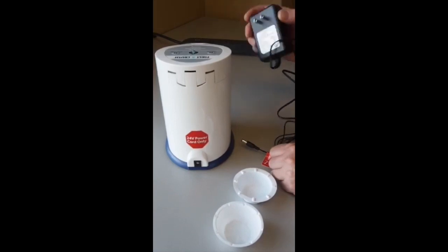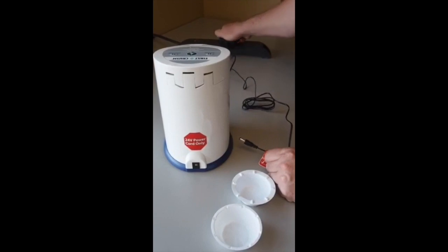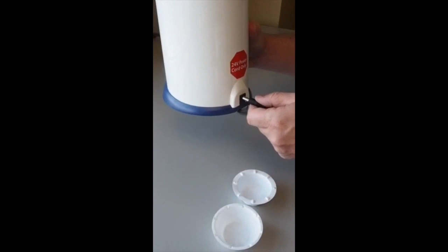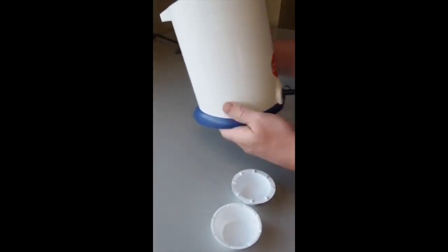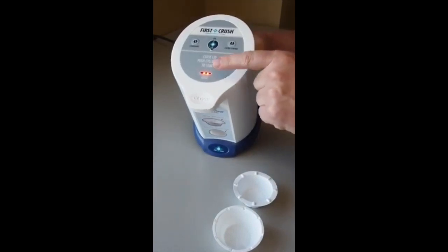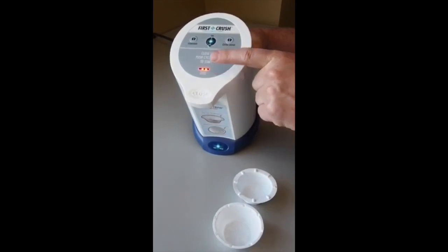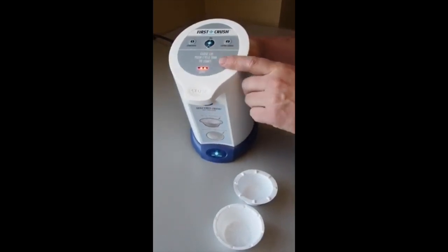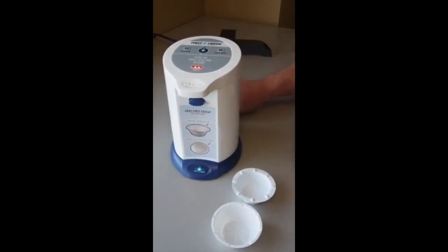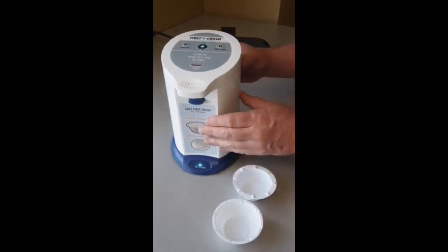The pronged end of the power cord goes into a normal wall outlet, either at the nurse's station or where you store your med carts, and the plug end of the power cord just simply goes into the back of the machine. When charging, a red light on the keypad will stay solid red until fully charged. A minimum of 15 minutes is required to charge the battery, and up to 3 hours on a completely dead battery. The same red light will turn itself off when fully charged and blink if ever the battery charge gets low.